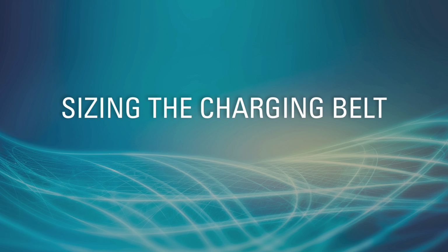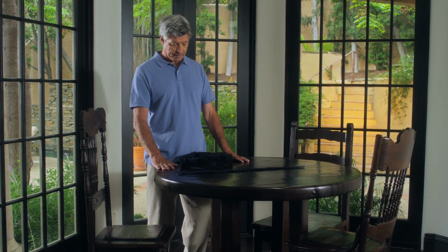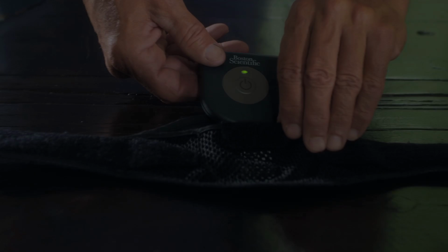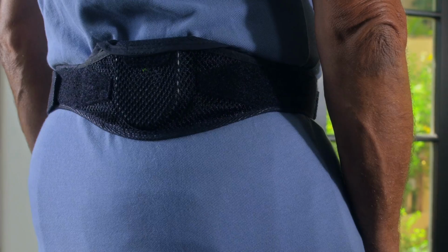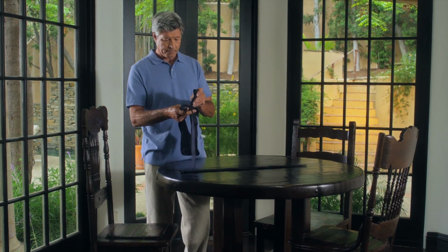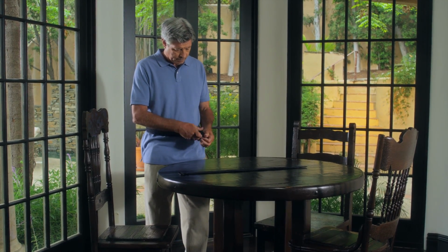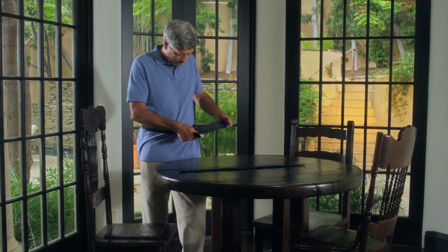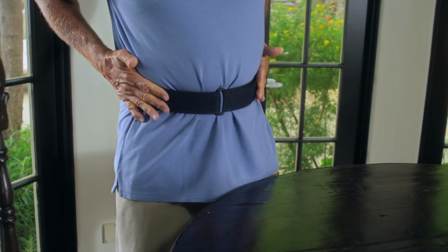Sizing the charging belt. The charger belt is designed specifically for use with the Boston Scientific charger. It lets you charge your stimulator by putting the charger into the belt pouch and wearing it directly over your stimulator. To adjust the length of the charger belt, place it around your body and insert each strap through the belt loop. Then secure both by using the fasteners.